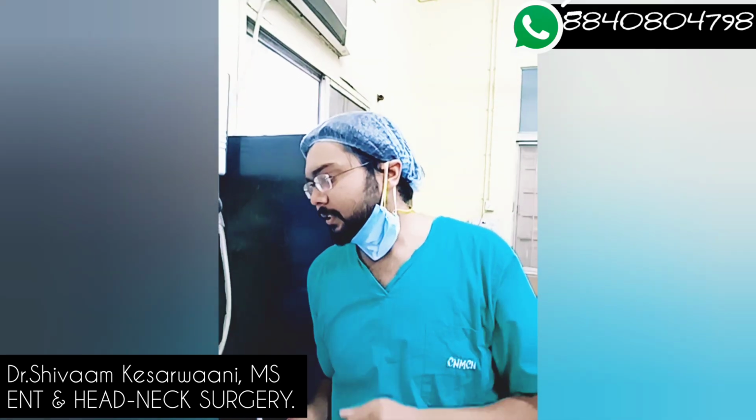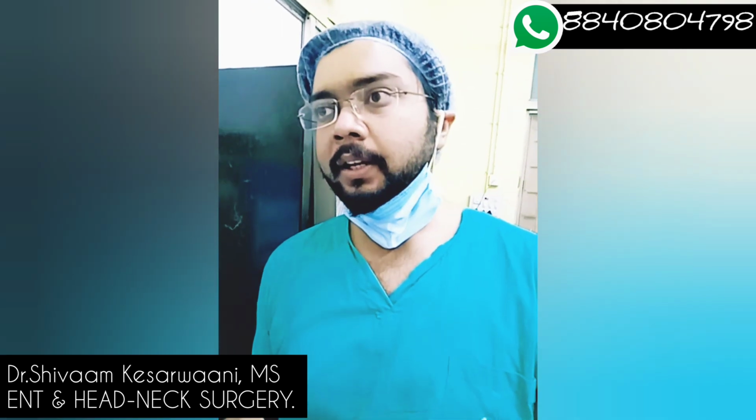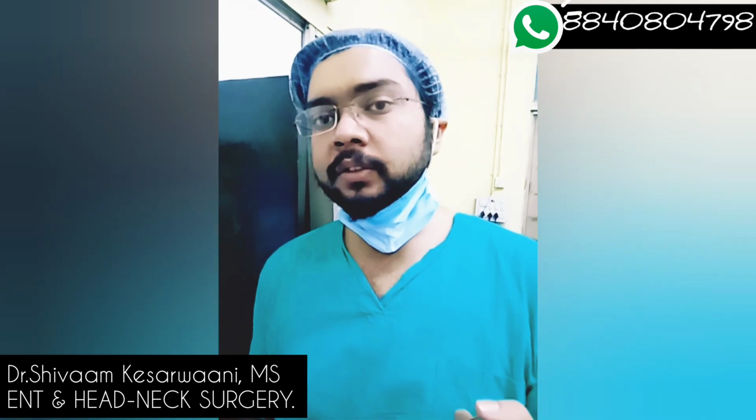So good day everybody. We got in another case which was referred to us. That case was operated for a sinonasal mass. That means endoscopic sinus surgery was done, assuming it as polyposis. So functional endoscopic sinus surgery was done. What happened in due course, the patient after a year came to us with complaints of nasal bleeding from that same nose. On histopathology, it was seen to be a case of inverted papilloma.